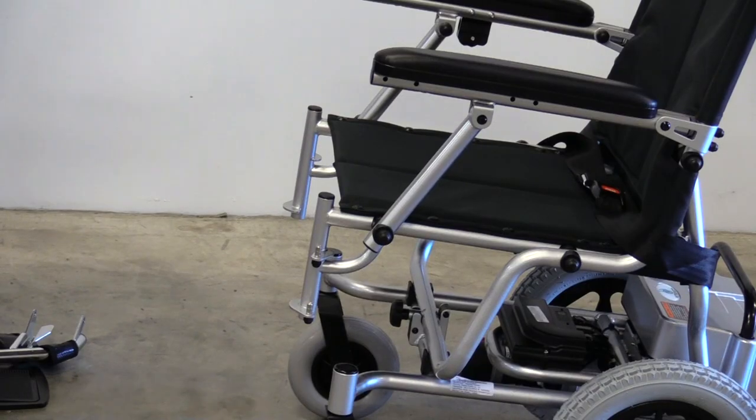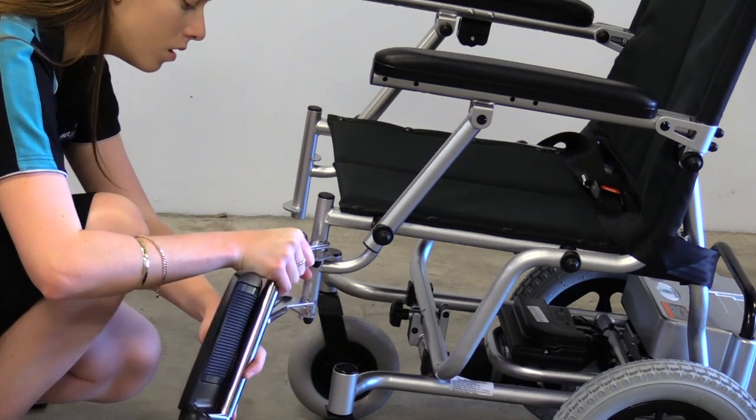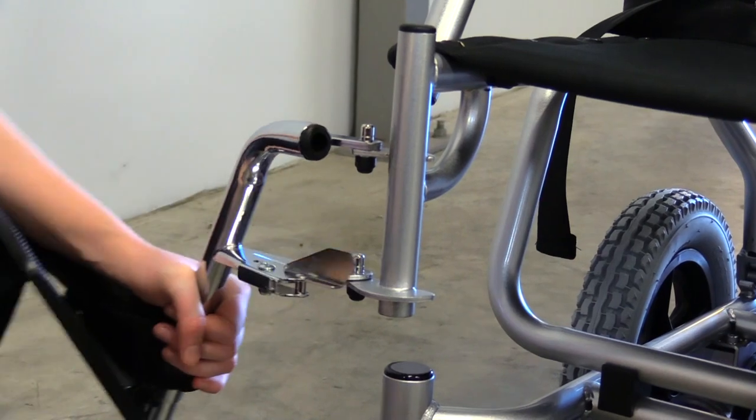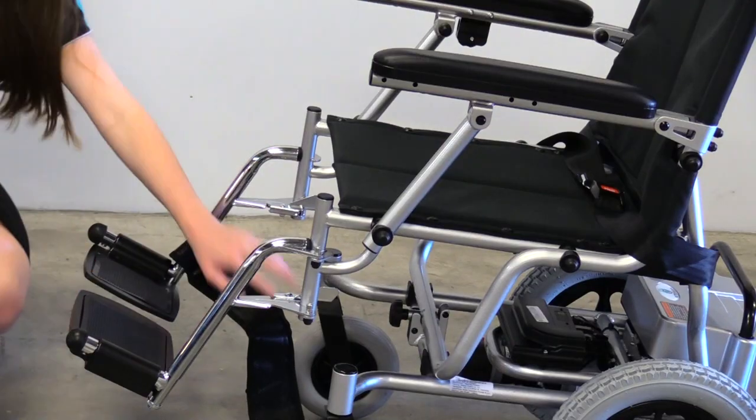To attach your leg rest, line the holes up with the metal rods. Push down and swing the leg rest to lock them into position. Attach the heel support.